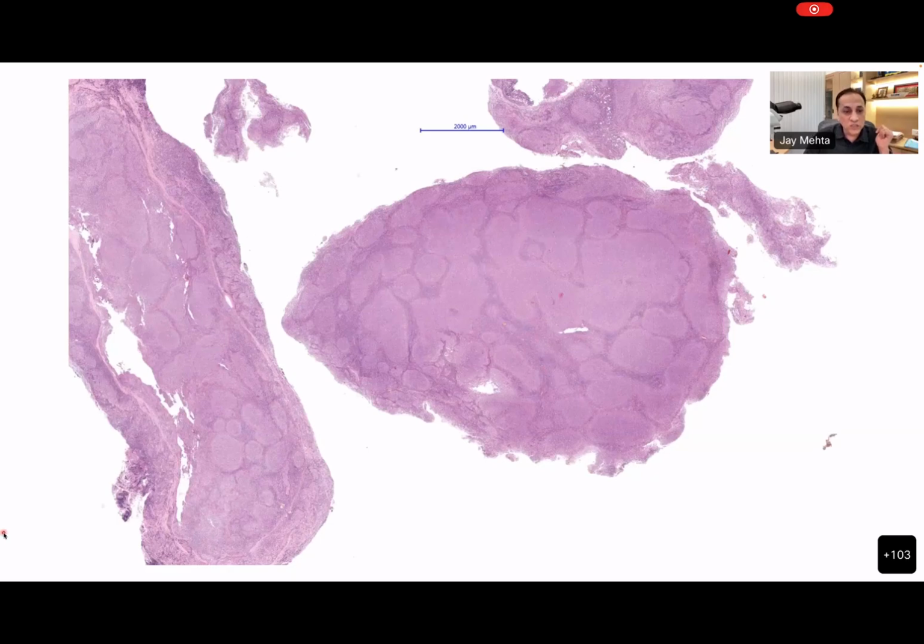And here's a node which is actually a follicular lymphoma. And when you can associate these things and call them definitely as follicles, what would you call these big structures here? These are definitely bigger than follicles, and this would qualify to be a nodule. But by convention, because we call it a follicular lymphoma, these all would be constituted as a follicular proliferation.